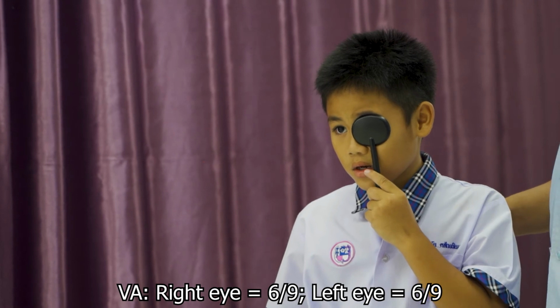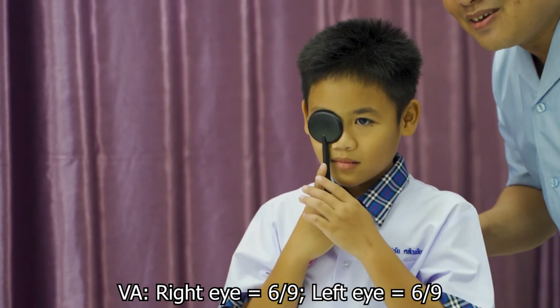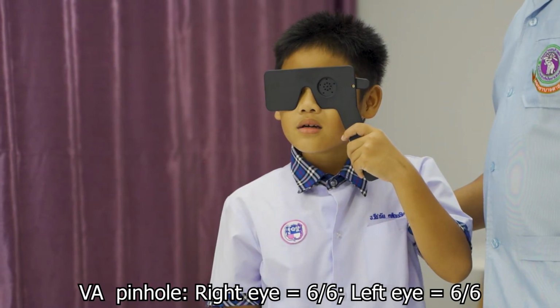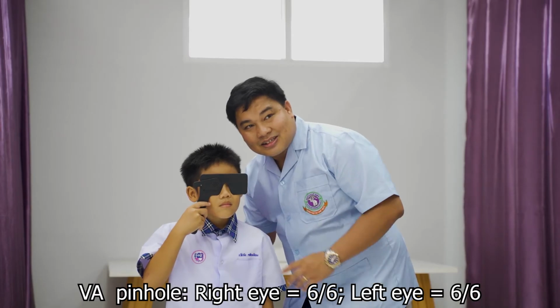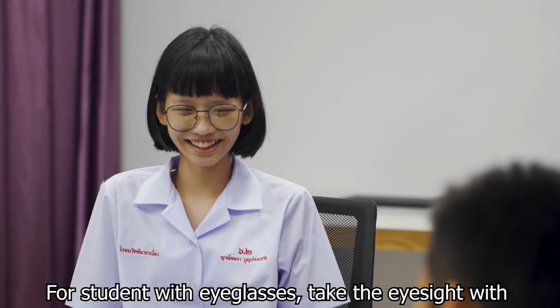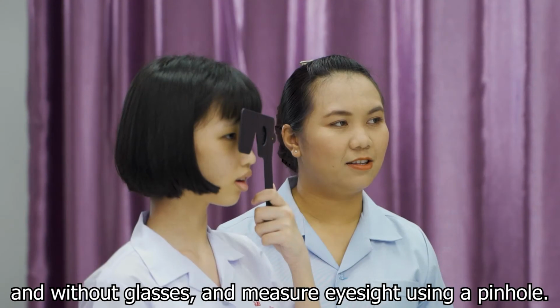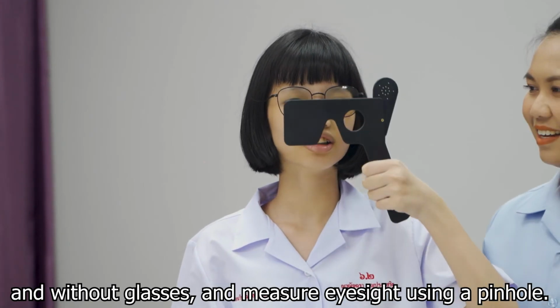Visual acuity: right eye equals 6/9, left eye equals 6/9. Visual acuity with pinhole: right eye equals 6/6, left eye equals 6/6. For students with eyeglasses, take the eyesight with and without glasses and measure eyesight using a pinhole.